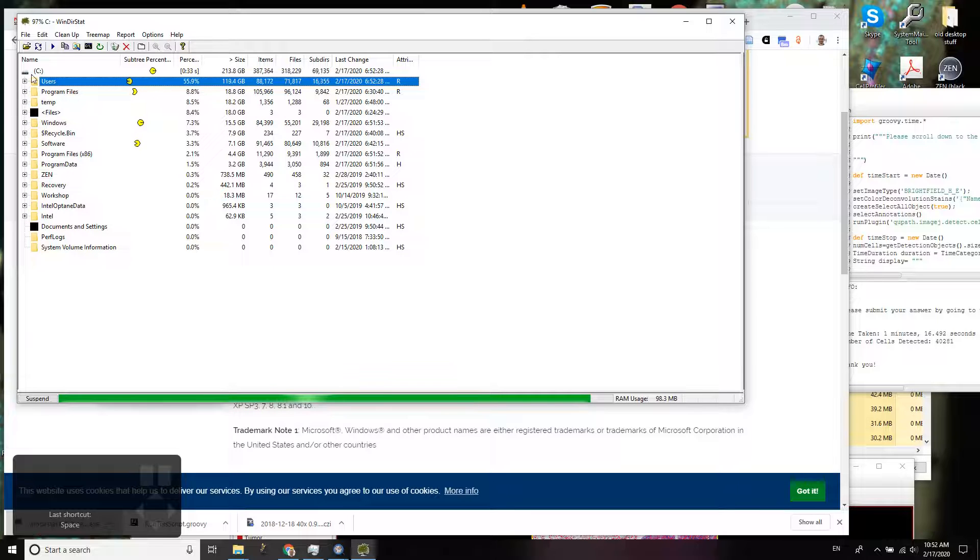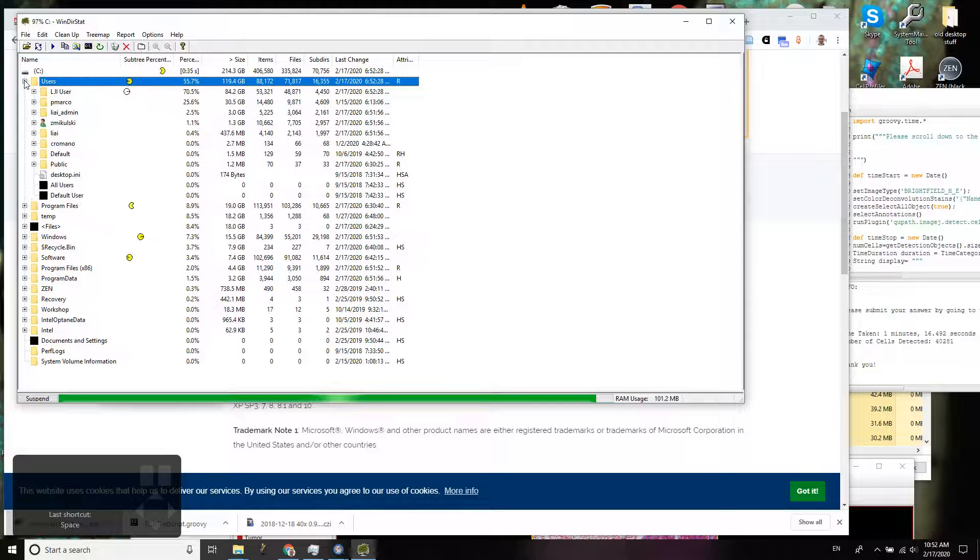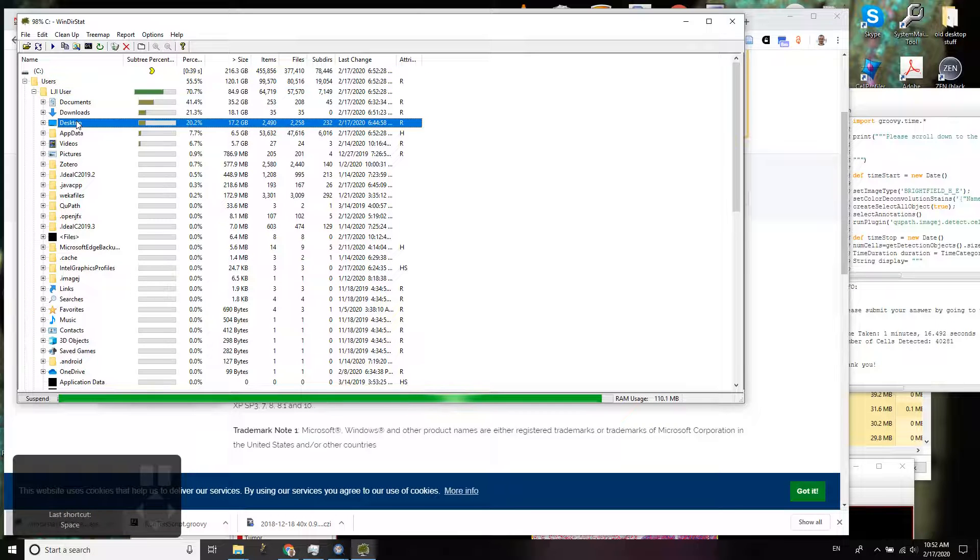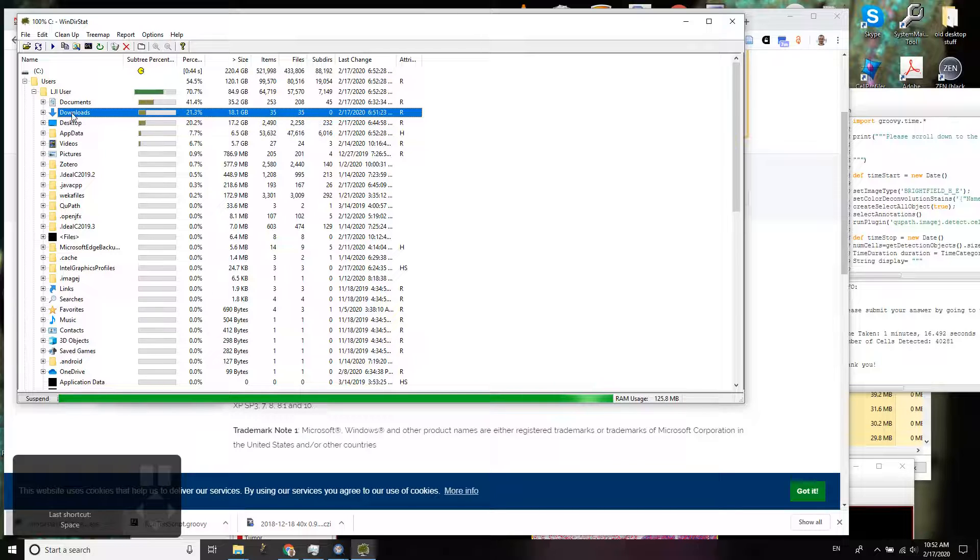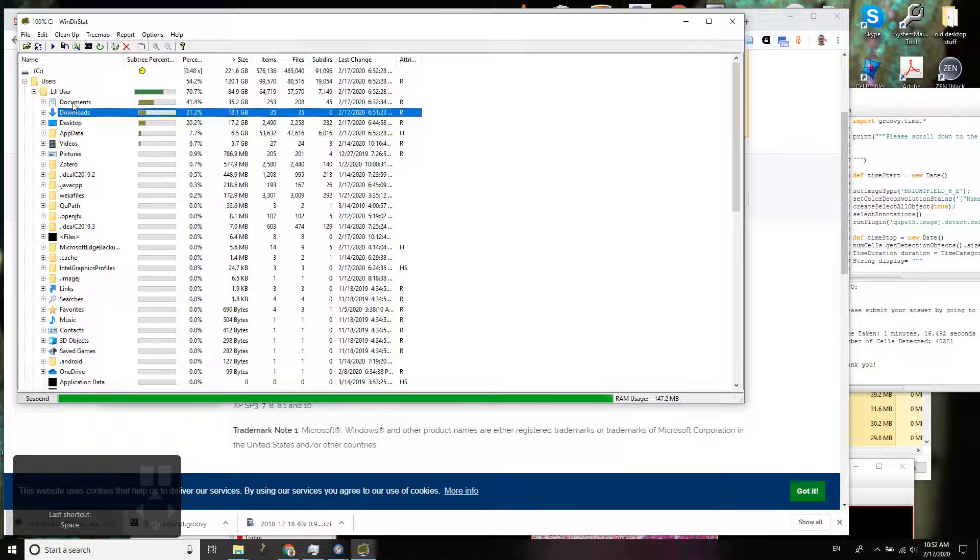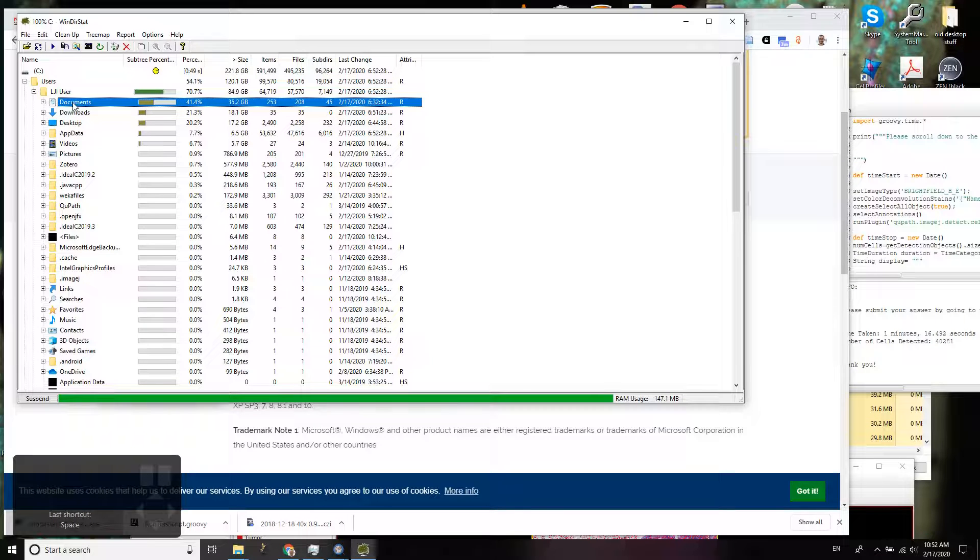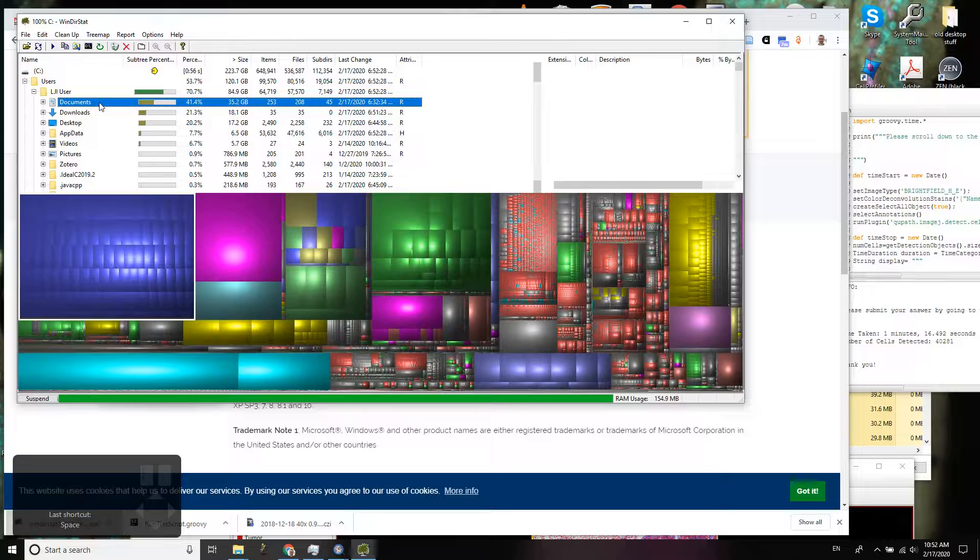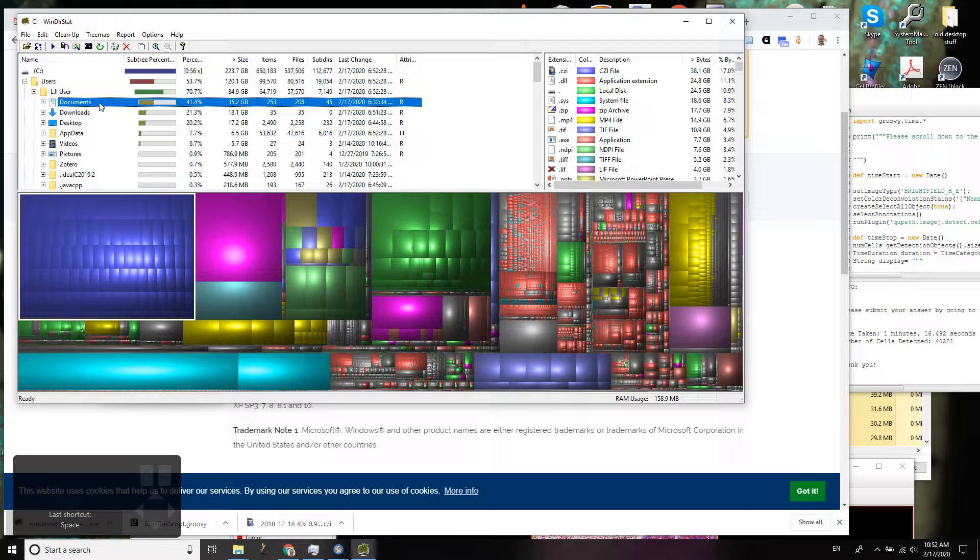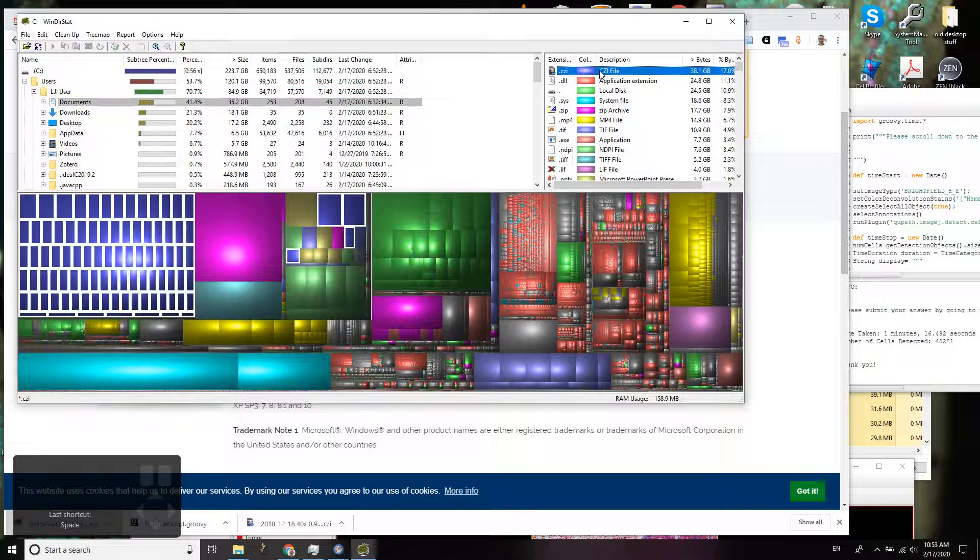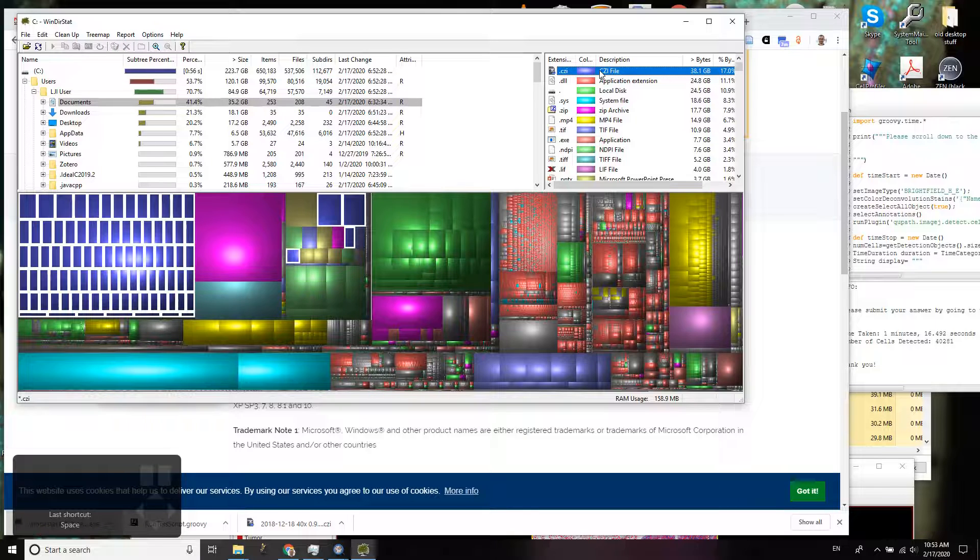And it turns out that I have a whopping 17 gigabytes on the desktop and 18 gigabytes in the downloads folder and then 35 gigabytes in my documents. So those are typically videos or images, files that you've copied from your cell phone and so on. And in my case there's already a lot of CZI files. Those are images from our slide scanner that we're going to be using on the workshop.